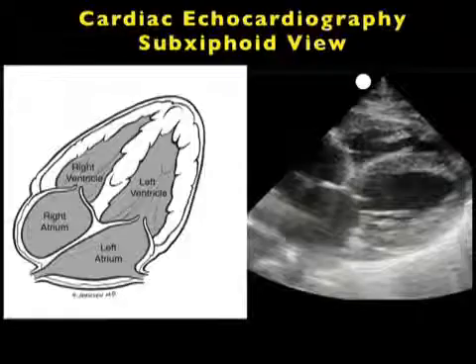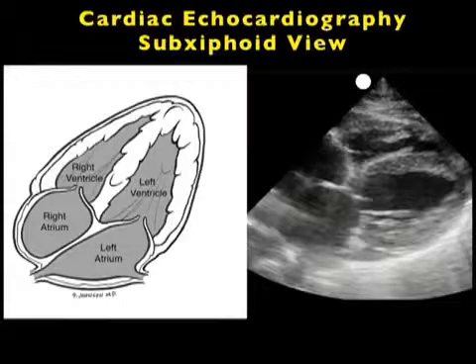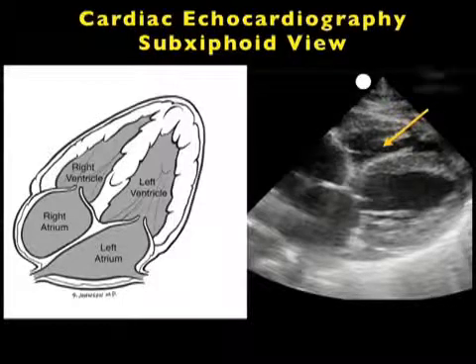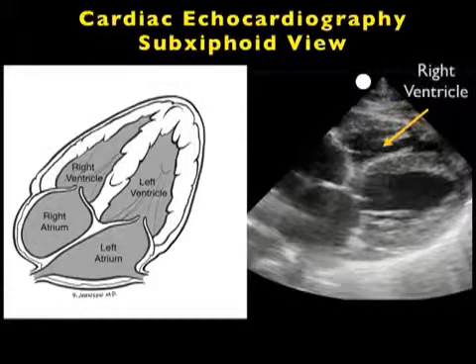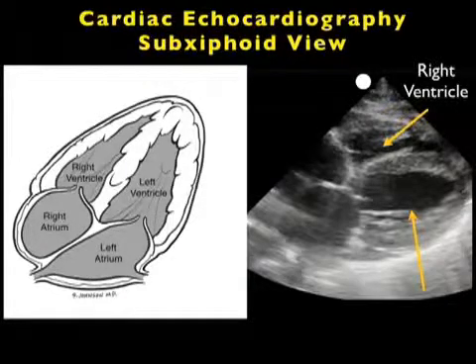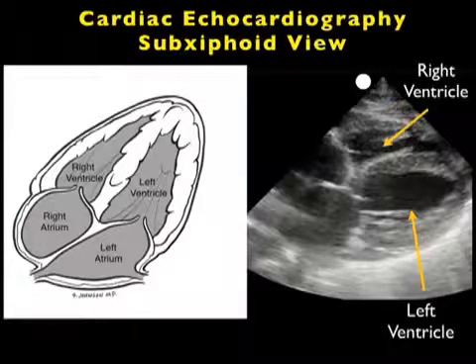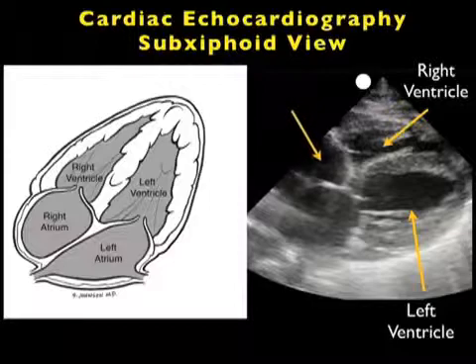Let's now take a look at the image that you'll obtain from the subxiphoid view of the heart. Here's a pictorial to the left and an ultrasound image to the right. The first chamber that we'll encounter directly below the liver — which is our acoustic window in this case onto the heart — will be the right ventricle. Immediately posterior to the right ventricle, we'll be seeing the left ventricle.